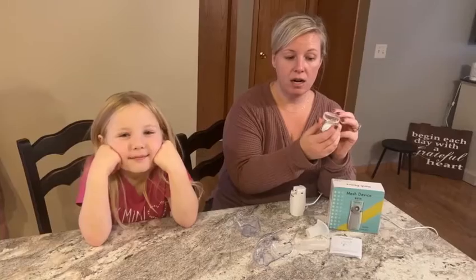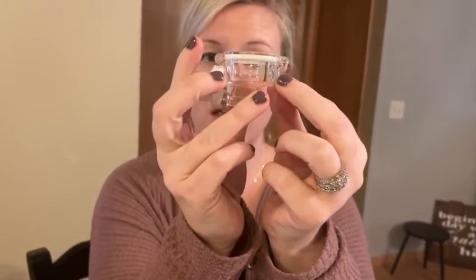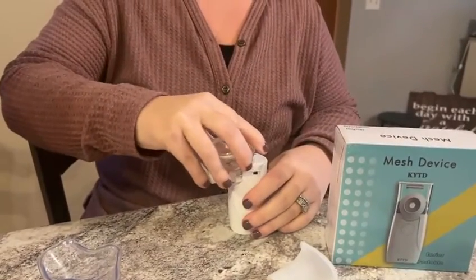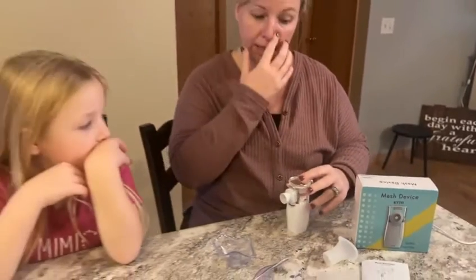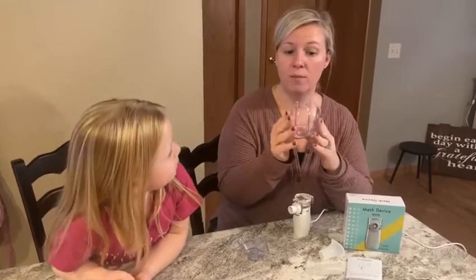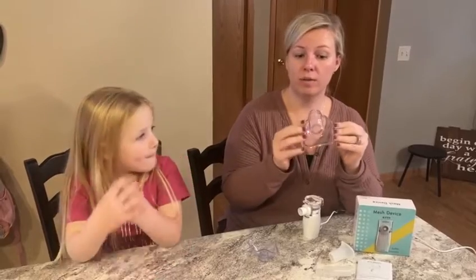Here is the top that goes in your medicine cap right there. I have a little bit of saline in there — she does not need a treatment right now, so we are good. That slides on. You also get an adult mask, so if my husband and I ever needed a treatment, we have that, which was nice.